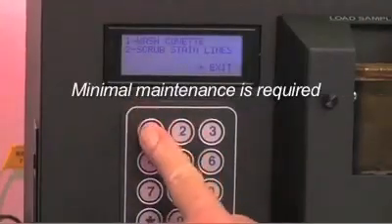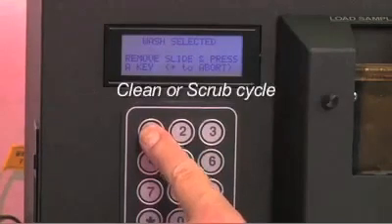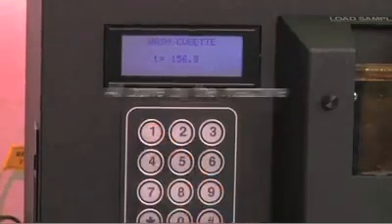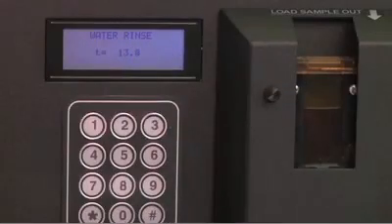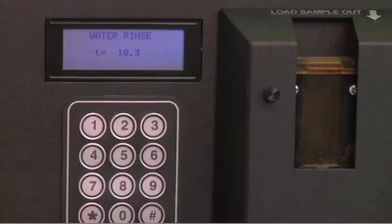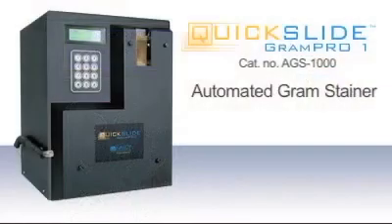Minimal maintenance is required. The Gram Pro 1's LCD screen prompts you when to run a clean or scrub cycle, all done by the machine. This only takes 3 to 5 minutes to complete. Follow the manufacturer's recommended cleaning program to keep your instrument working smoothly.